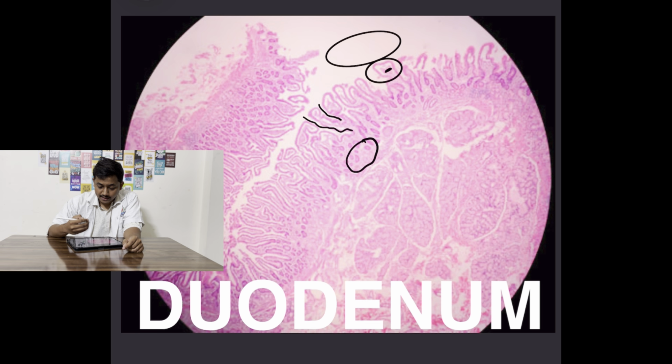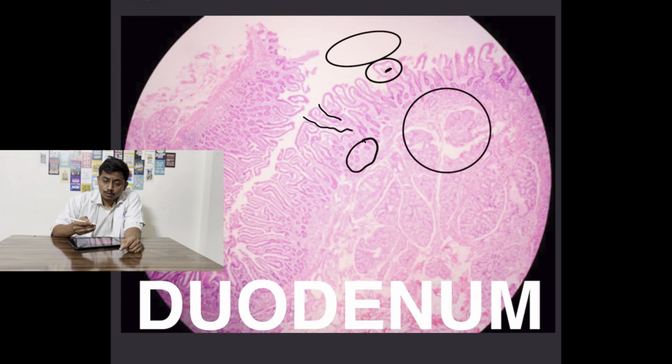The next thing that is most important is the muscularis layer. There are two layers of muscularis, that is the inner circular and the outer longitudinal layer. The last thing that you should be noting in the duodenum is the lining. The lining of the duodenum is by simple columnar epithelium and you can identify it very easily.